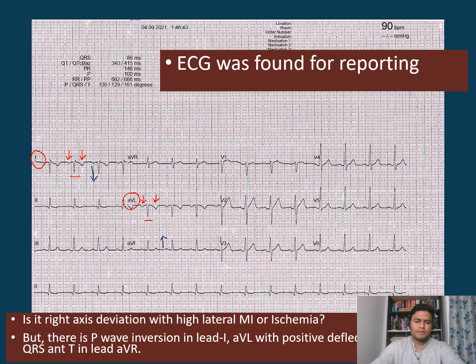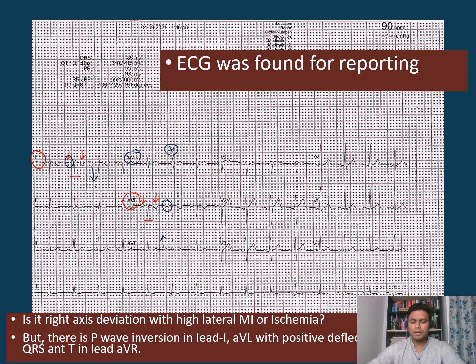The P inversion in lead I actually indicates something else. If you look at lead AVR, it is positive, which is unusual — AVR should have negative deflection of the P, QRS, and T. But here the P seems to be positive or equiphasic, the QRS is positive, and the T is also positive. So AVR is positive, lead I is inverted, and lead AVL is inverted.